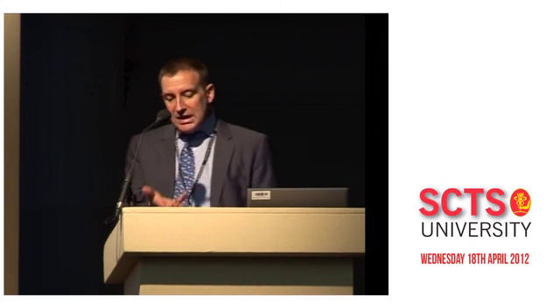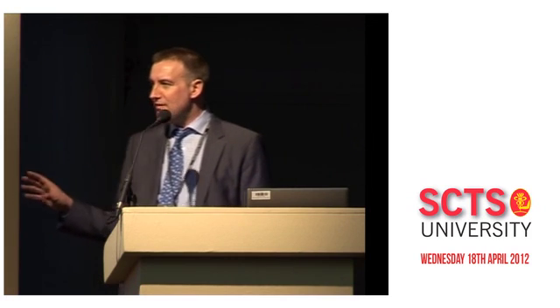They're having their pacing wires taken out at this point, and their drains. There's a whole load of things where you can get late bleeding following cardiac surgery, and this is the rationale. There's a very limited amount in the literature about this kind of situation. There's a huge amount of cardiology recommendations about treatment of AF and anticoagulation, but it doesn't really address the post-cardiac surgery population in intensive care. My rationale is I'd rather do a TOE than anticoagulate these patients because of the risks of late bleeding, late tamponade and problems following pacing wire removal.